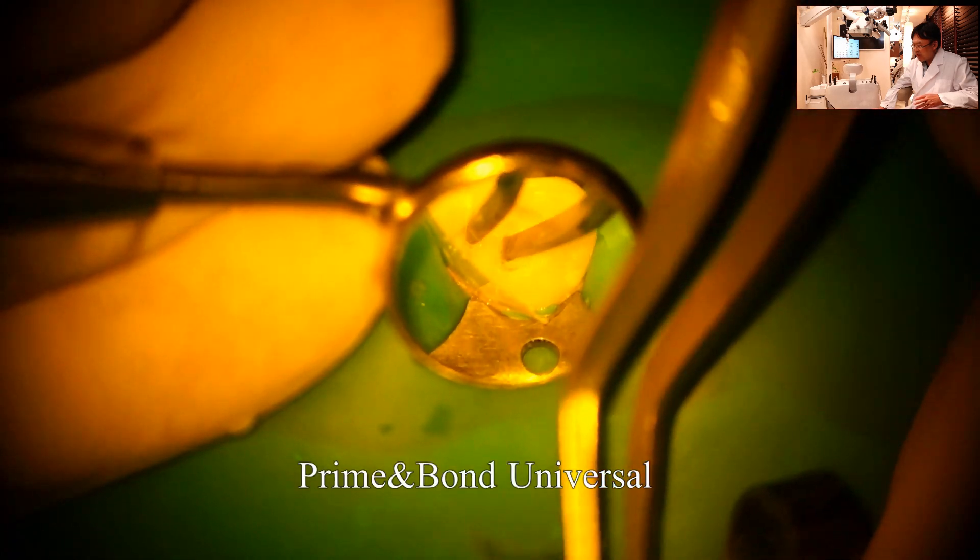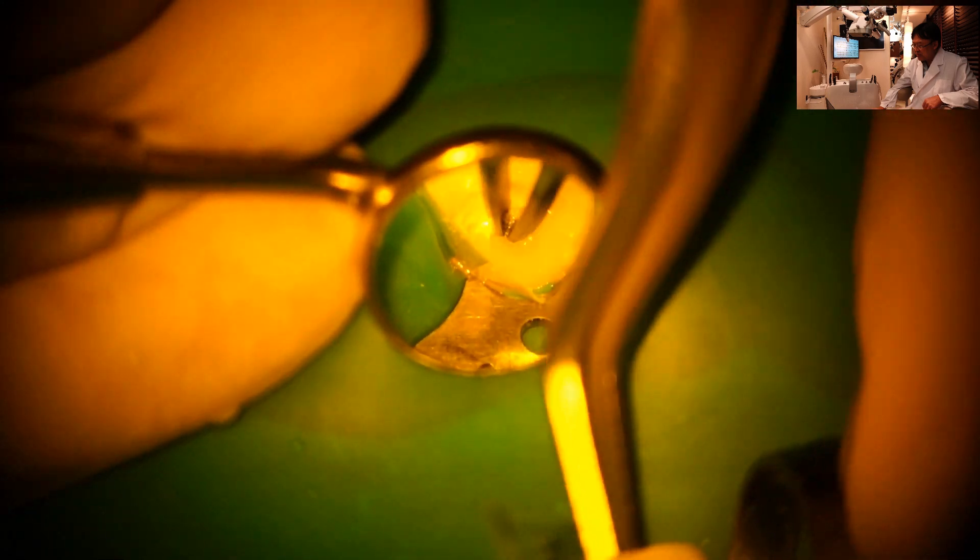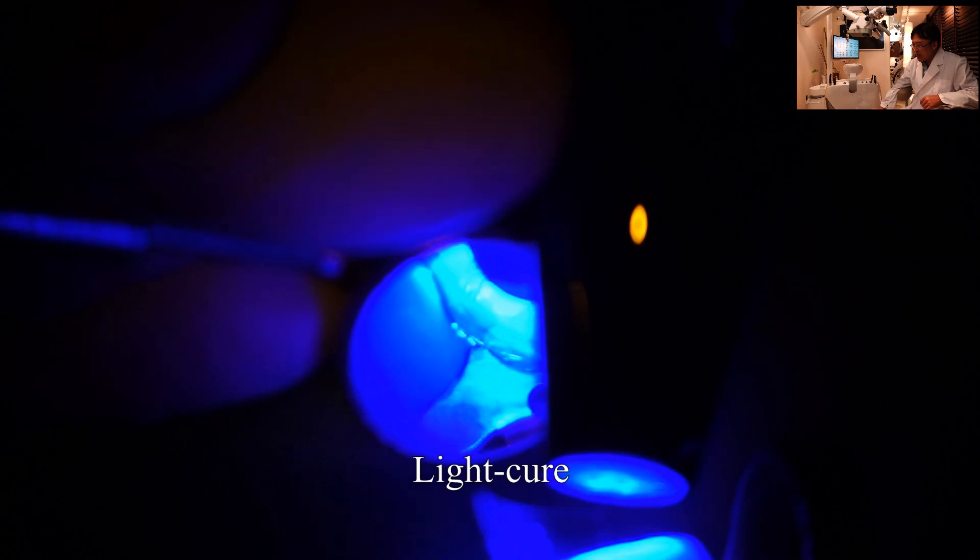This is Prime & Bond Universal. This is a bonding system for composite restoration. And I dry the cavity and light cure it.